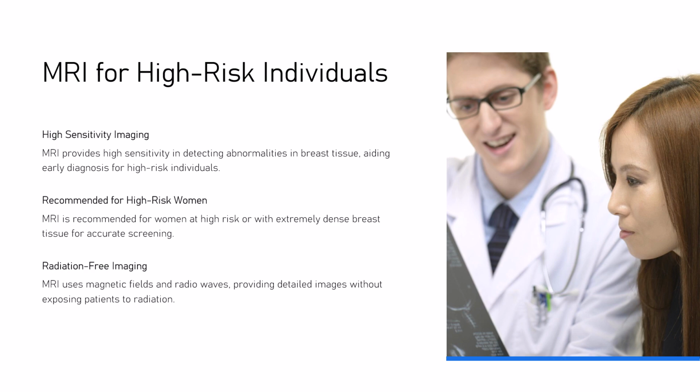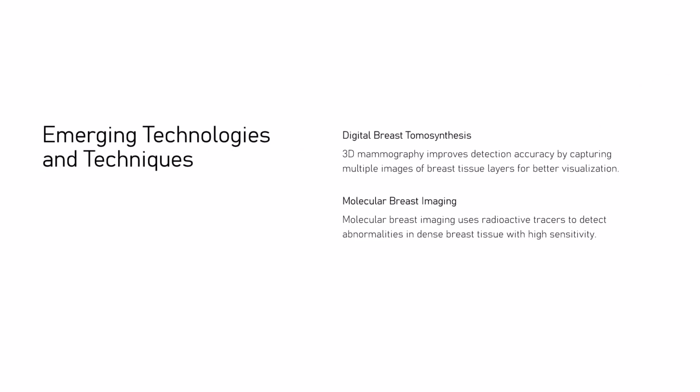Magnetic resonance imaging offers high sensitivity and is recommended for women at higher risk for breast cancer or with extremely dense tissue. It provides detailed images without radiation exposure. New imaging methods like digital breast tomosynthesis, which is the 3D mammography, and molecular breast imaging are being developed to enhance detection accuracy in dense tissue.